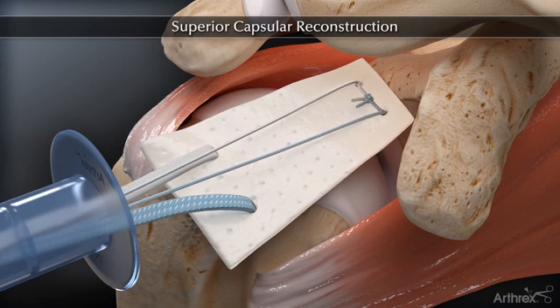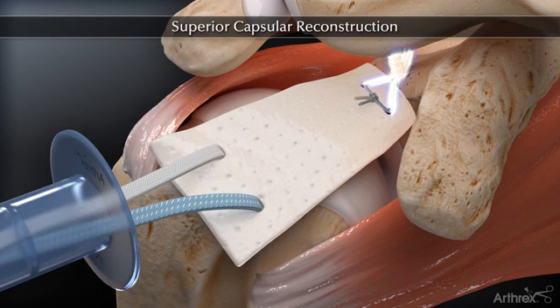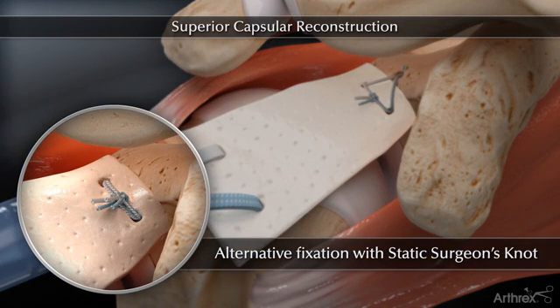Tensioning the opposing suture strands will pull and position the graft onto the superior glenoid. A knotless labral swivel lock can be used to fixate the medial sutures or, as an alternative, the two fiber wire suture limbs can be tied using a static surgeon's knot.